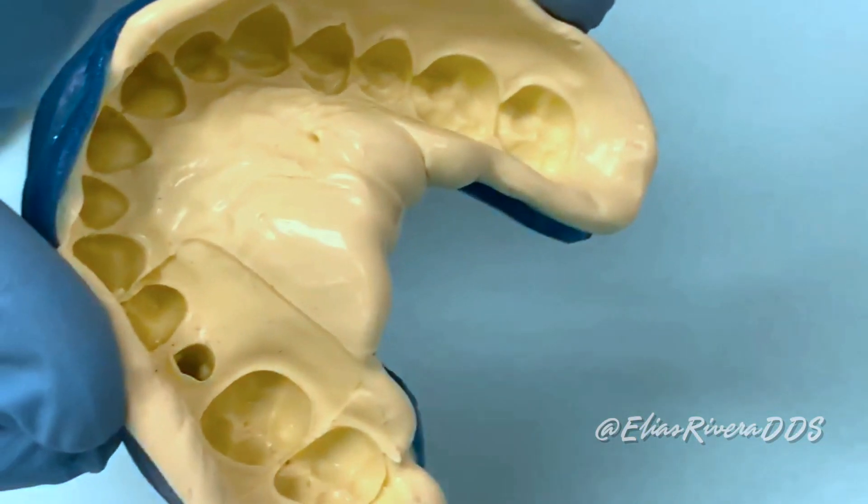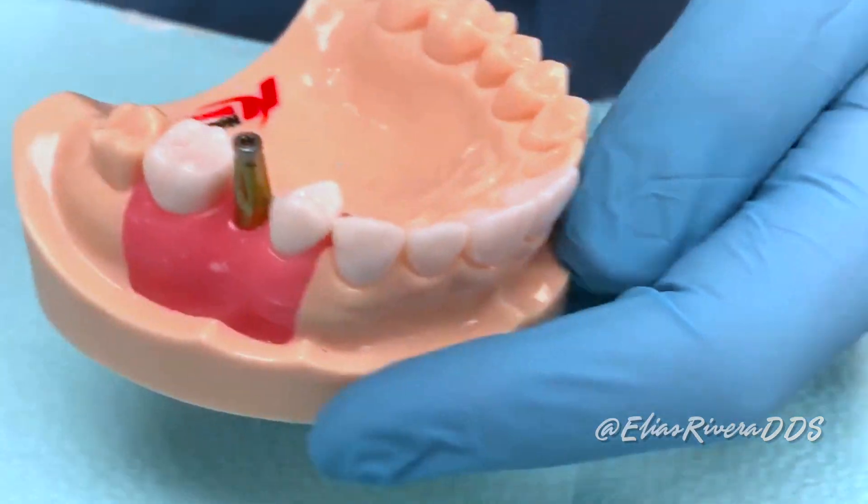Step number four: remove the impression coping from the implant using the manual screwdriver.